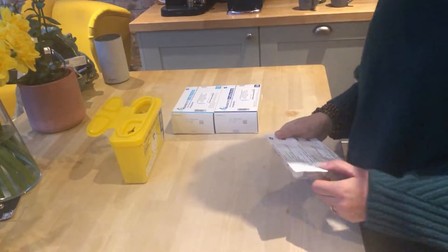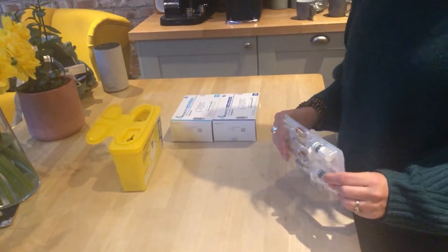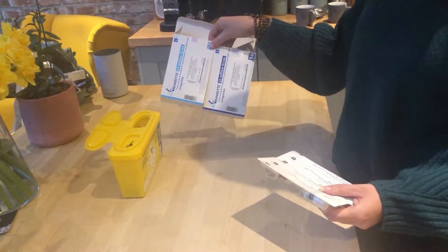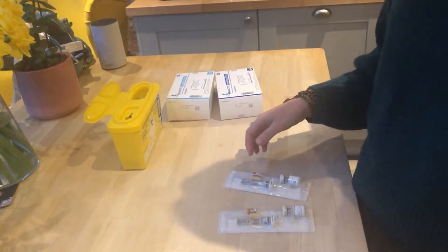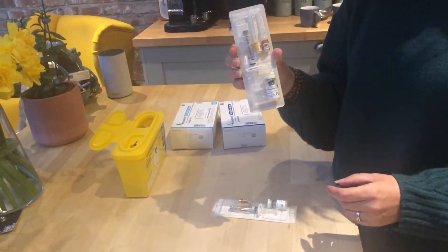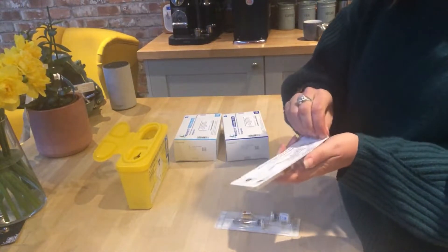Hi everyone, so we're just going to do a quick demonstration of how to mix and administer GCSF injections. We've got two different types here, 13 million and 34 million. Some of you might be mixing if your nurse has told you that you can, some of you might just have one pack that you need to administer. So just always consult your consultant and let them know what you need to do.